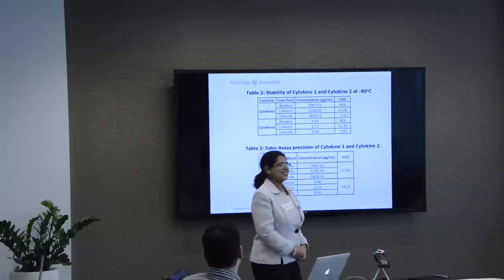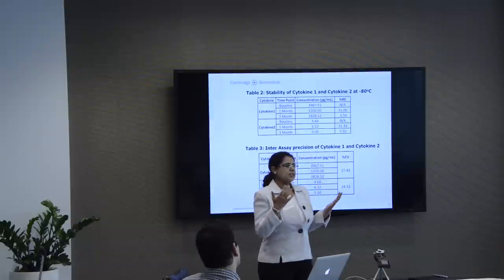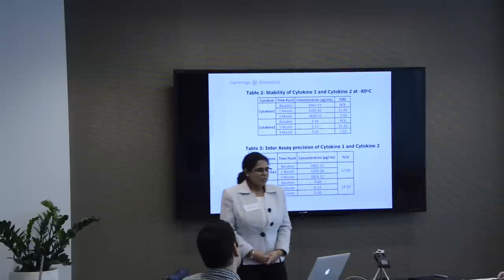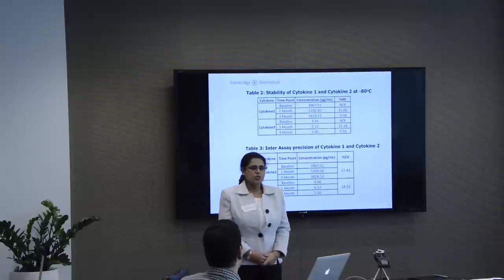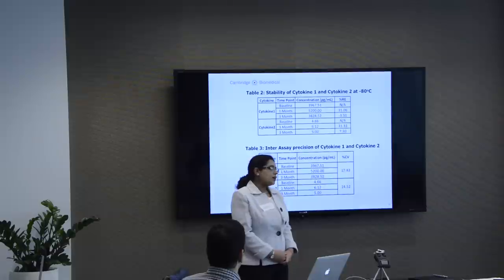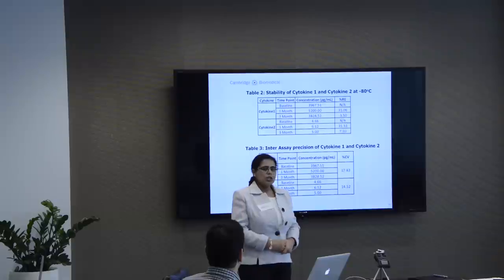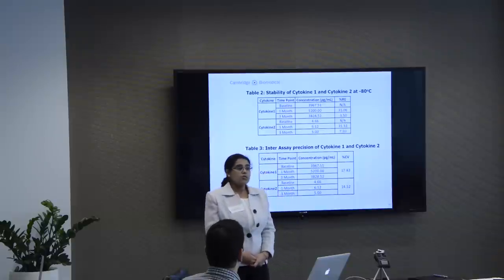Yeah, good question. I'm sure people here would probably answer this question better, but the kit stability is done by the manufacturer. And we also look at the standard curve and the mean fluorescence intensities, and as long as they are within that 10-15% range, they are stable. So we actually look at the stability studies of the kit in-house too.